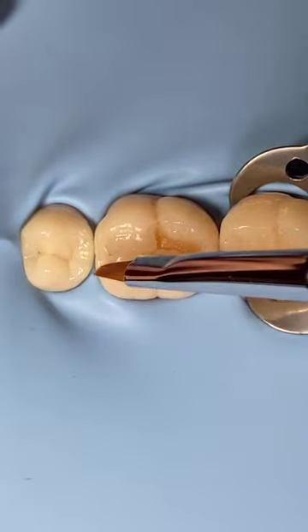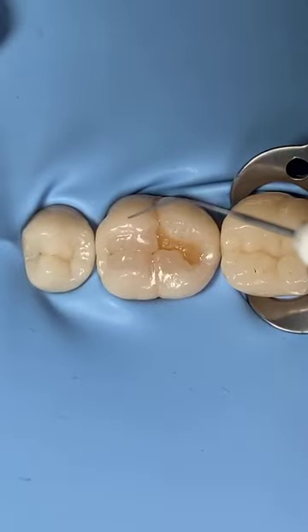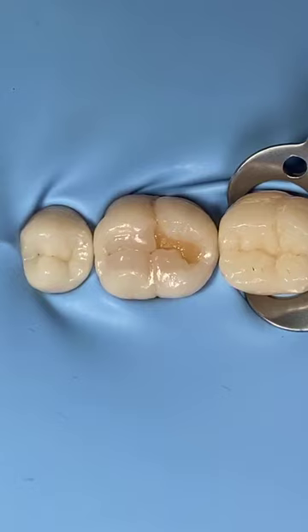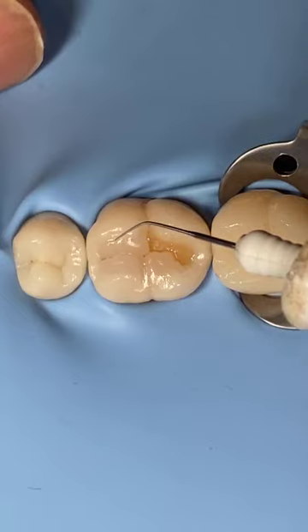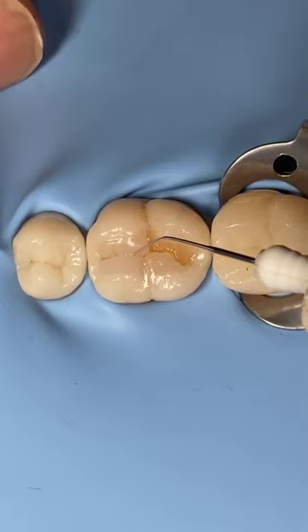Okay, I'm gonna put it back. So the dot technique, basically all you need to do is create 3 or 4 dots before you scratch, before you separate the composite. So it will be easy to make a very thin separation. I will give you an example here. I will create 4 or 5 dots here. This is my first dot, second dot, third dot, 4, 5, 6 maybe.